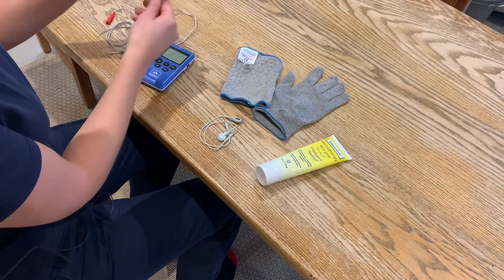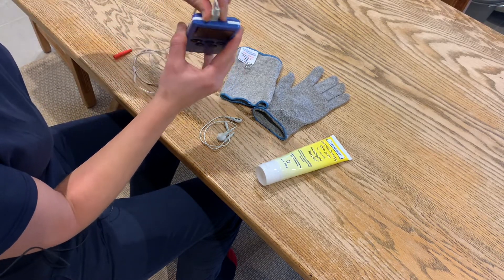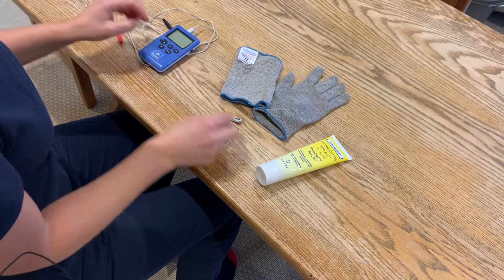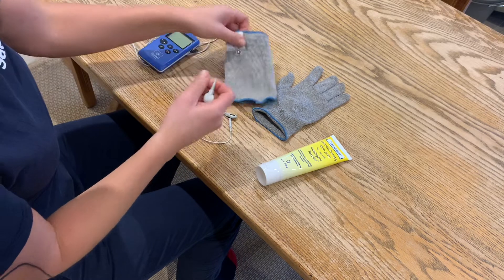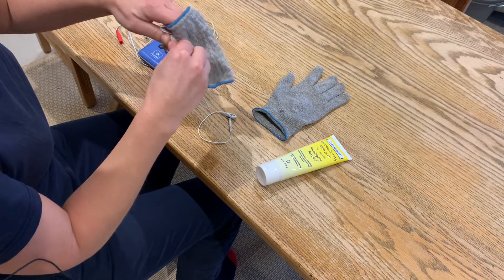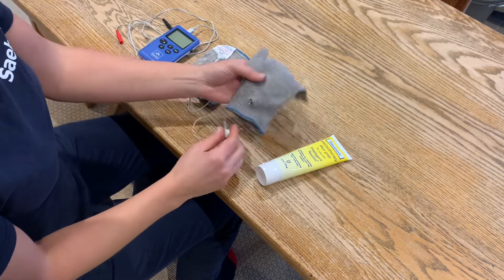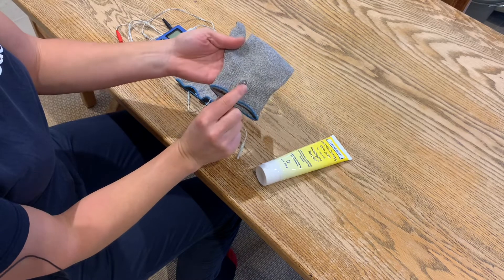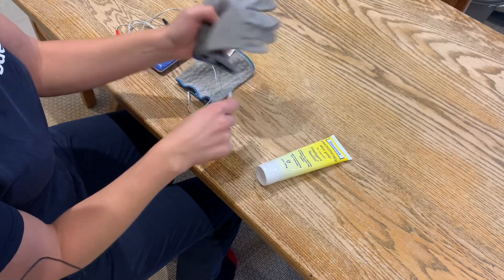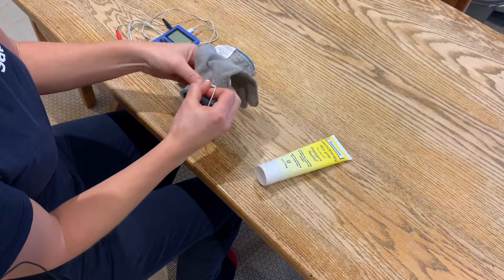Step one is connect all your leads. One of the Pro leads goes into output A at the top of the device. Then your two snap connectors — press on firmly until you hear them click, and same with the glove. The glove has a press stud top and bottom. You want to have the snap connector on the top of your hand, so for my right hand it's going to be this stud.